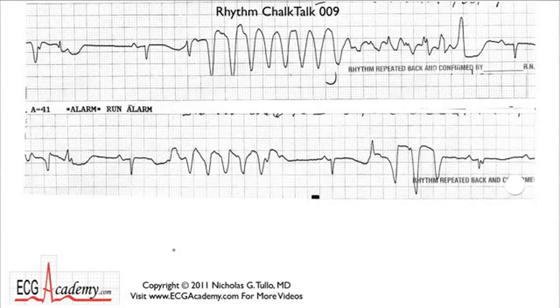Chalk Talks assume you know the basics, so what I'm trying to do is get you used to reading more complicated tracings. And this time I'm going to do it a little bit differently. We're going to talk clinically, okay? Because a lot of you will have to take board questions, and I want you to get thinking along those lines. So let's imagine a case, okay?